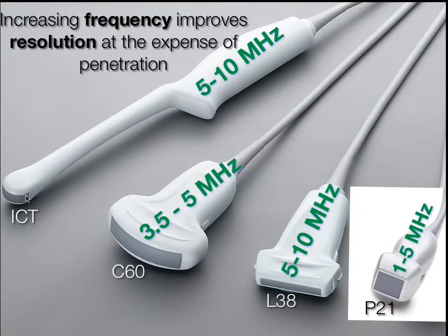And when you put that high frequency transducer on a stick, and now you can get it closer to the organ of interest, like the uterus, well, you could take advantage of that close proximity now and turn up the frequency. And so you'll get much better resolution, which is why of 100 pelvic ultrasounds I do a month, probably 75–80% of the time or more, I'm using this endovaginal transducer.